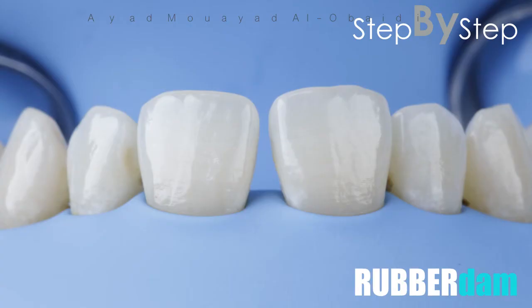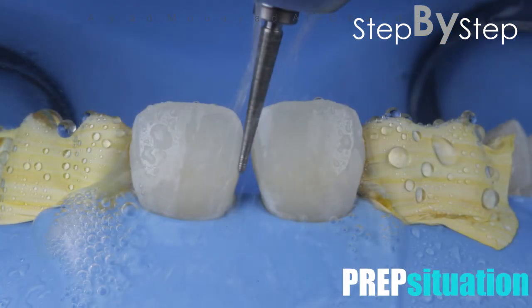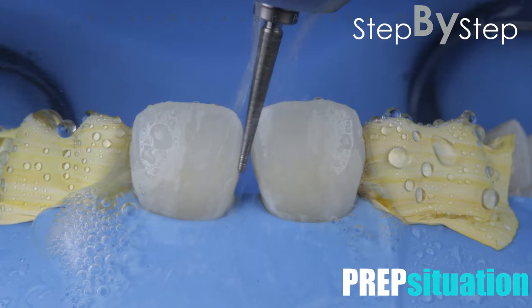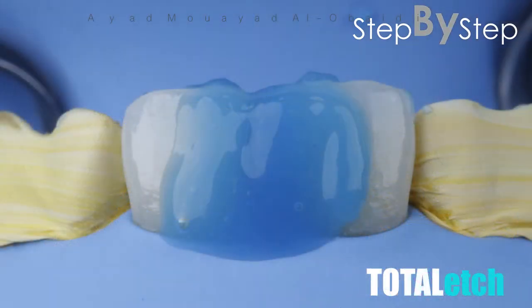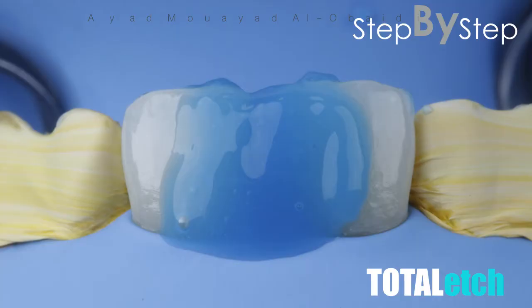After that, we perform complete isolation for the case using rubber dam. Regarding prep: we do only scratching of the outer enamel surface to increase the surface area, remove aprismatic enamel, and achieve high bond strength. Since we are dealing with enamel surface, the highest bond strength can be achieved using the total etch technique.